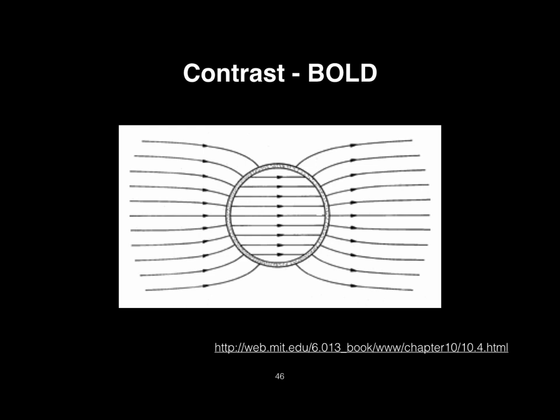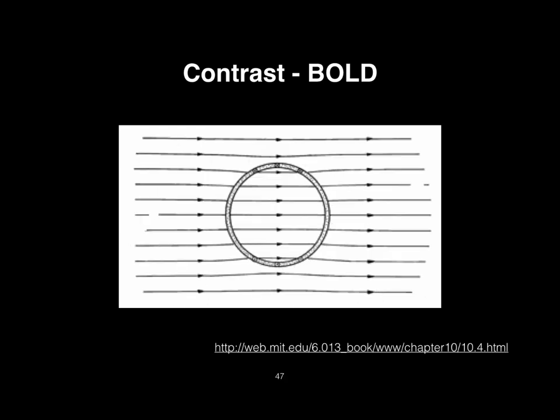All right. If now you have your subject or your animal do something where you engage the surrounding bit of cortex, okay, the BOLD, what we've come to learn is now you have an oversupply of oxygen and oxyhemoglobin, contrary to what people first thought the effect would be. And it turns out now, because you have more oxyhemoglobin, less deoxyhemoglobin, the magnetic field in the blood vessel actually becomes slightly weaker and more analogous to what's outside.